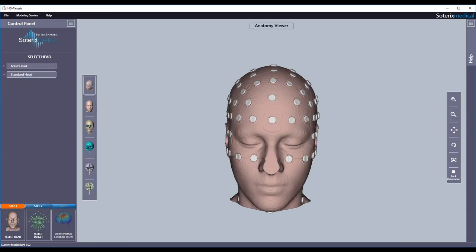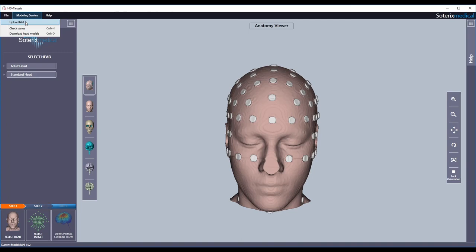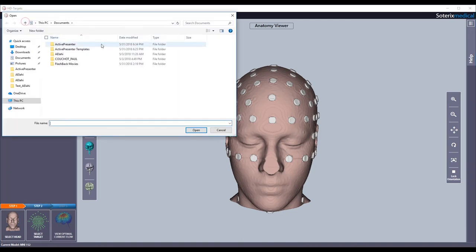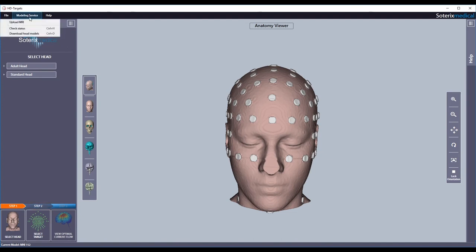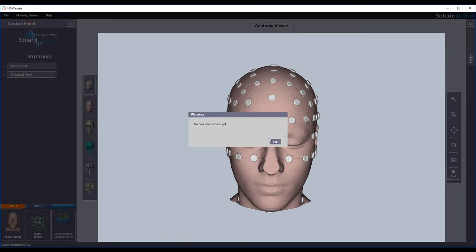Now let's see our individualized modeling service feature. You simply hit the modeling service tab in the top bar. From the menu, select upload MRI to upload your subject's anatomical MRI to our web server. The data uploaded is saved on the cloud using a unique encrypted password. You can check the status of your solutions at any time by clicking the check status option.